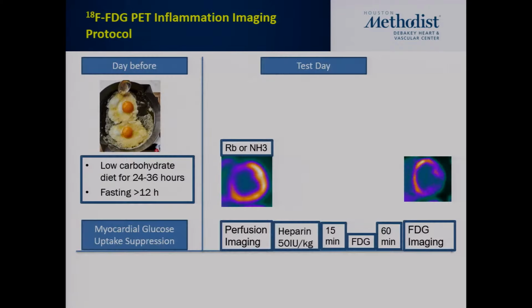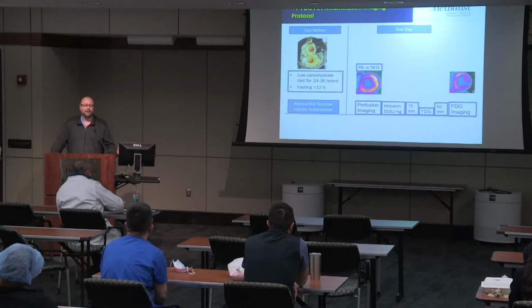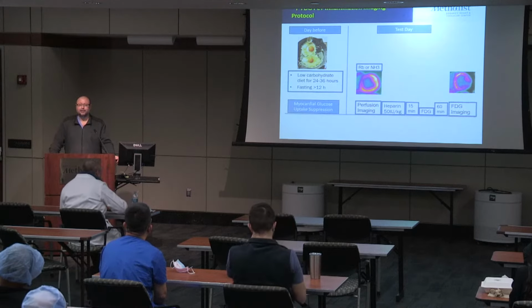So first of all, the protocol that is done here is very different, because when I was standing on this podium a few weeks ago, I was telling you about viability, and I was telling you we want the myocytes to take the FDG that we give. Now we don't want the myocytes to take the FDG.